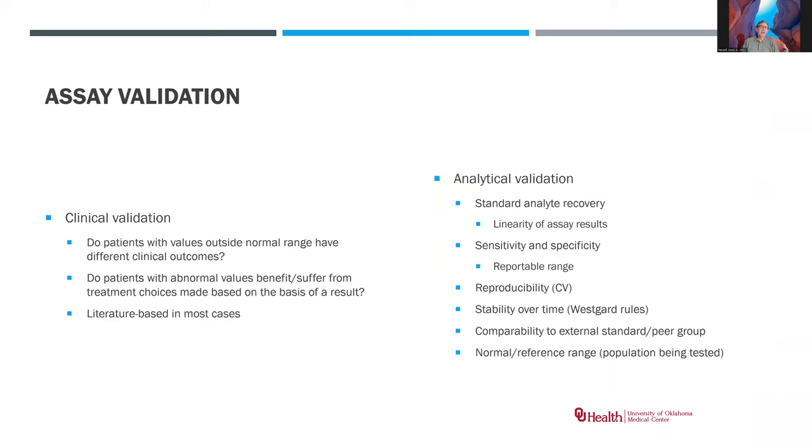Well, let's talk about assay validation. And when we speak about validation, there really are two kinds of validation to be concerned about. And this is very important. There's the clinical validation. In other words, do patients with values outside this normal range have different outcomes? Is this really a clinically important difference? Is my assay providing an important clinical value?